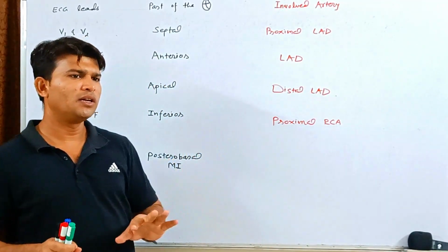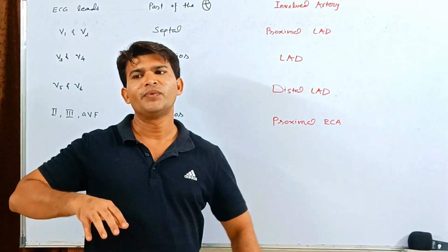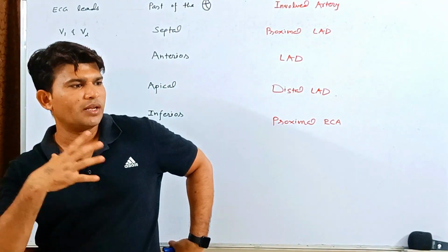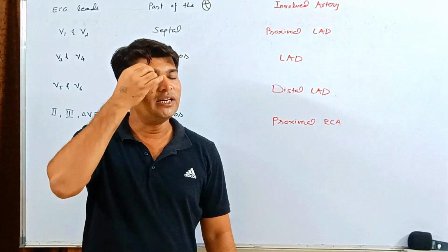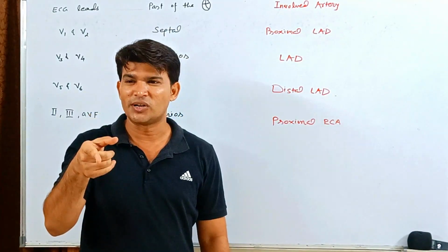Reciprocal changes in V1 and V2 and to some degree V3, that is, ST segment depression.